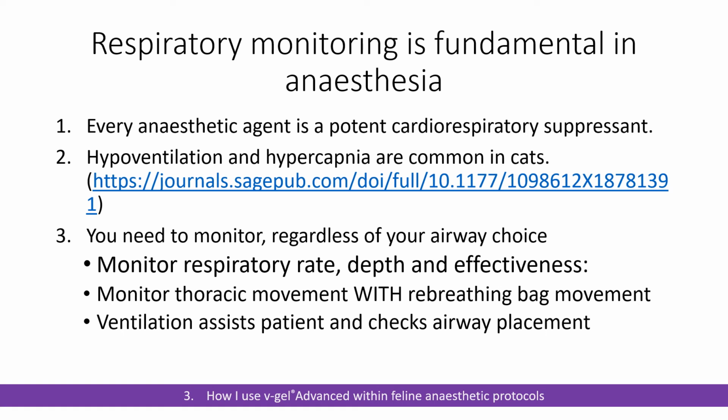Of course, when you ventilate your patient, you're also immediately checking and feeling how well your airway management tool is working. So is your endotracheal tube in the right place? Is it kinked? Is it blocked? Is your V-gel device working effectively? That sort of thing.